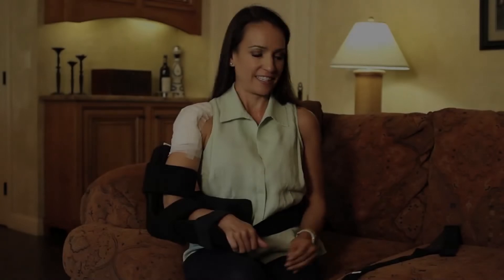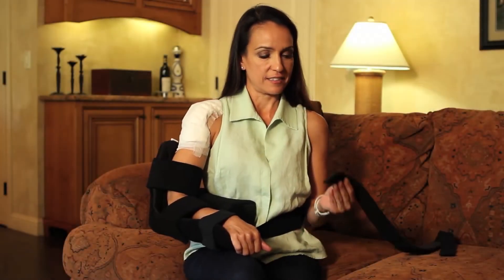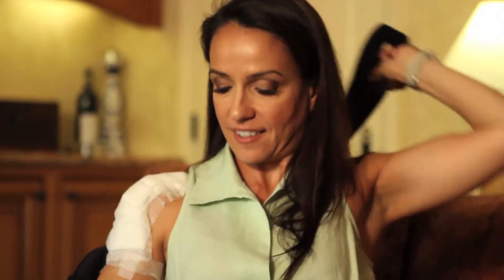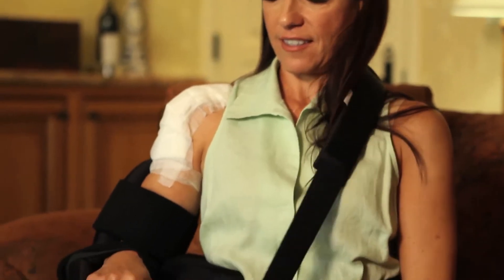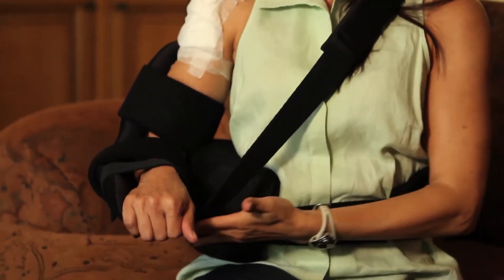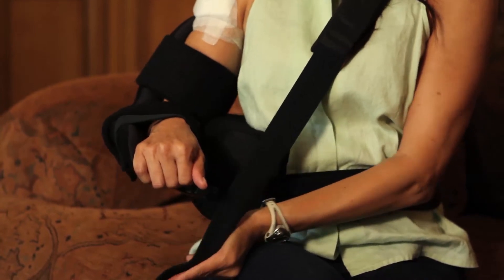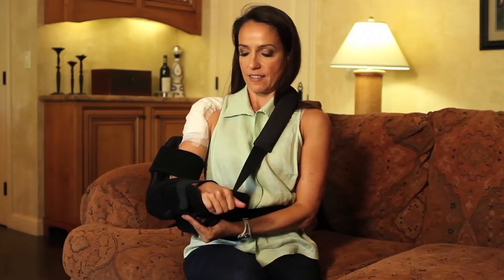The shoulder cradle is designed to work without a neck strap, but if additional support is desired for the arm, the optional neck strap can be used. Simply attach one end to the back of the cradle, bring it over the shoulder, and attach the other end on the underside of the cradle. The strap is elastic and the tightness can be adjusted by moving the attachment points.